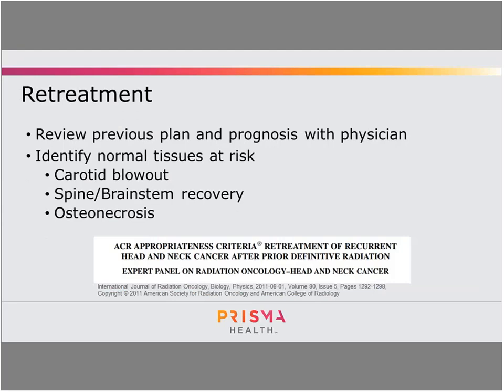Go over the complication and toxicity risk and try to figure out when toxicities could happen and what those would be. It's important to determine if this is a new primary or a recurrence, because recurrences can sometimes be a little more radio-resistant. So in general, these aren't great scenarios. But when you get around 100 gray, there are different structures you need to take into account too.